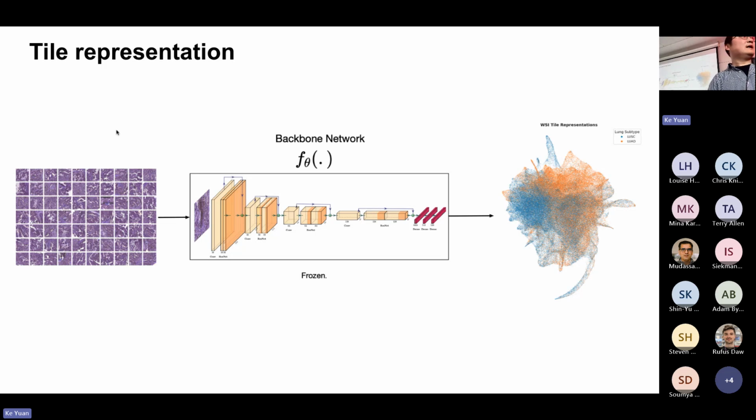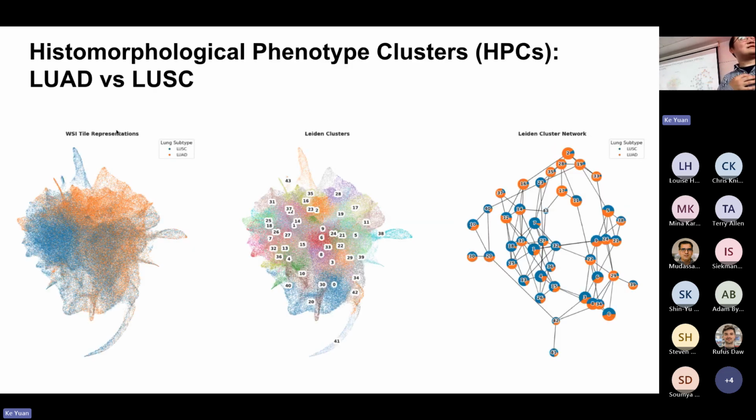So at that time, the way we were thinking about getting those guides, or a guide of histology, is to do clustering based on those neural network representations. Here you see an example of a UMAP projection of this. We didn't invent anything new. We just took the approach that was really pioneered in the single cell community, where they have a similar problem. They have loads of cells, and each cell has quite high dimensional data.